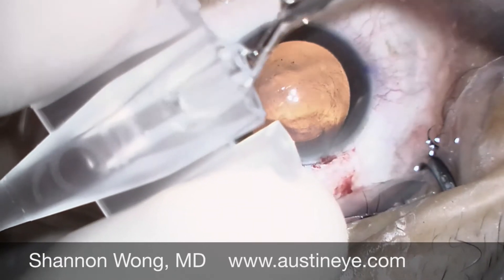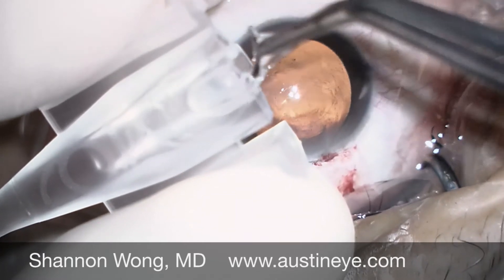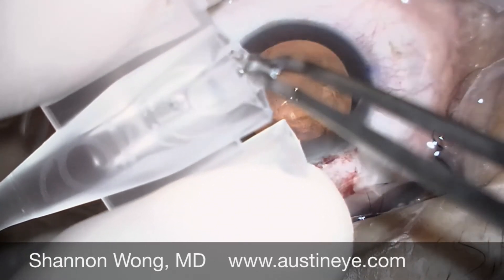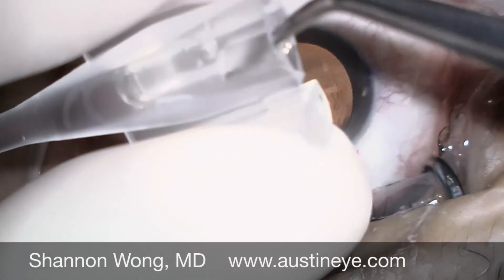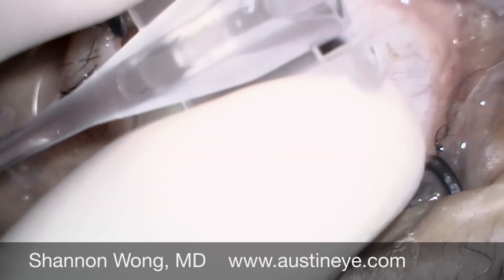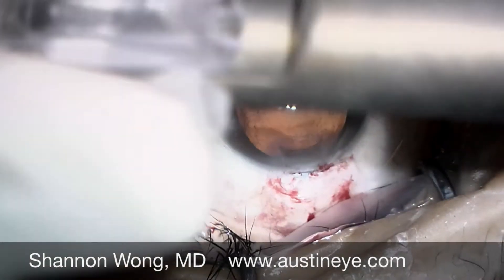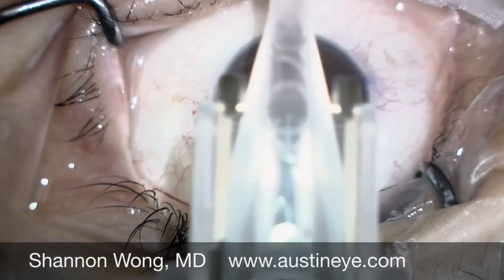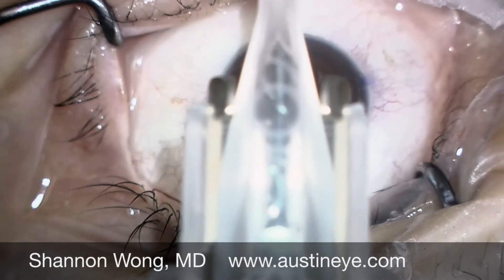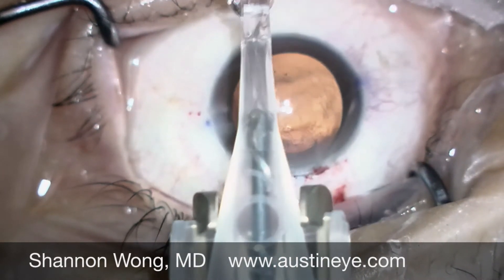We try and place the trailing haptic over the optic, then we place it into our platinum inserter and look at it through the microscope. Here the tip of the inserter is pushing on the optic, and the trailing haptic is still on top of the inserter tip.